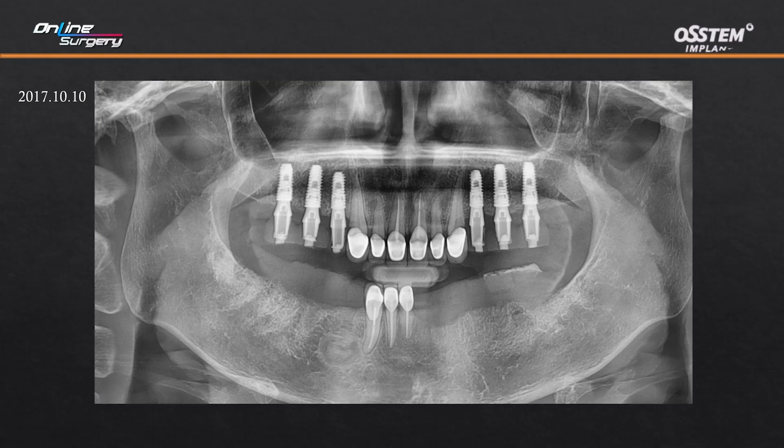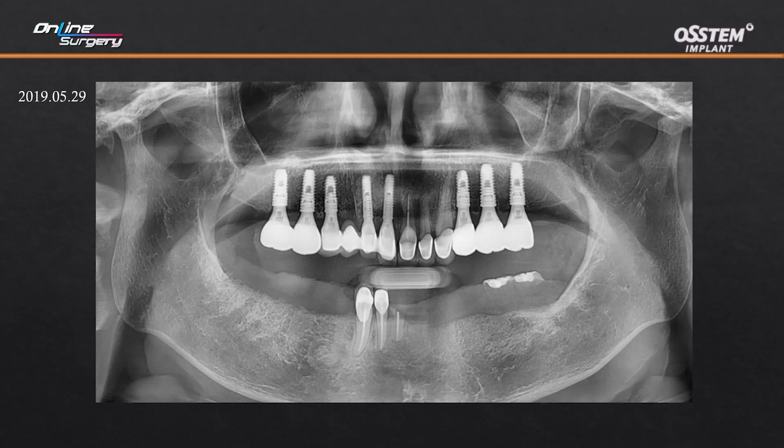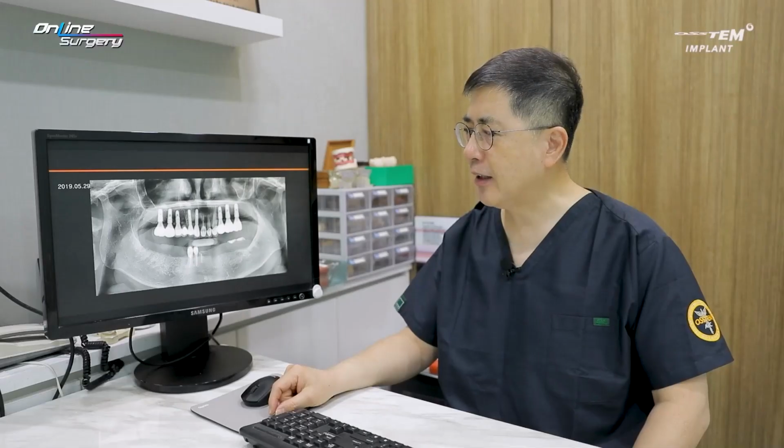This is 1 month after implant surgery, and this is after 1-fit CAD/CAM abutment was connected. And after the patient wore provisional for a period, about 2 weeks later, abutment level impression was taken to make final prosthesis. After that, the patient's anterior teeth were damaged, and the implant towards the anterior side was used to provide a restoration once again, and this is the panoramic image of it. Unfortunately, the patient refused to take the final intraoral photo, so there's no image. Now let's look at the video of live surgery which I've done in 2017 Moscow Forum.